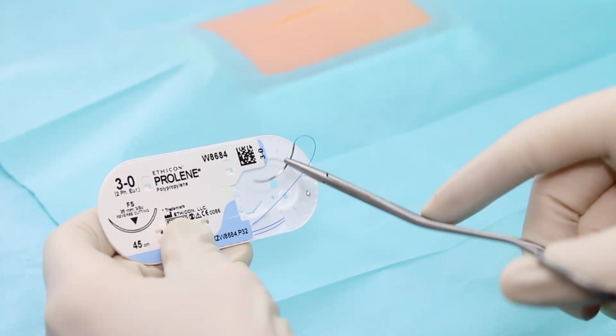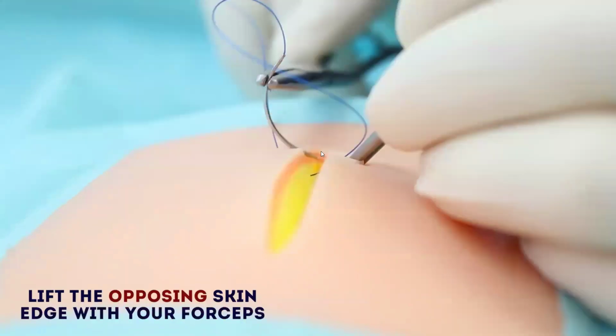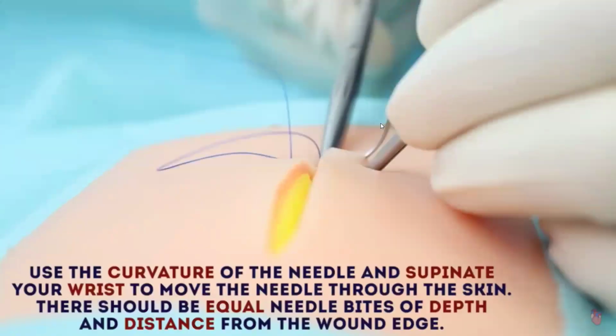Then you will insert inside the edge of the wound. The insertion will be half centimeter lateral to the edge, half centimeter to the other edge, and half centimeter away from the start of the wound. So half centimeter, half centimeter, half centimeter. You have two ways, both accepted. You can hold one edge and insert, then the other edge and insert, or you can hold both edges by forceps and insert one time. Clear? It's up to you.